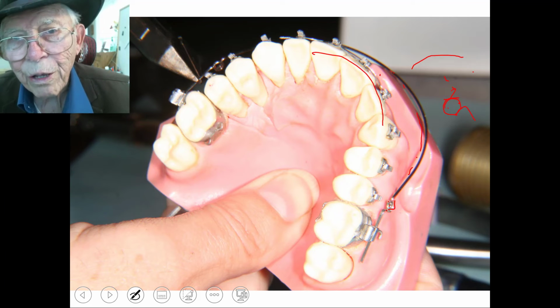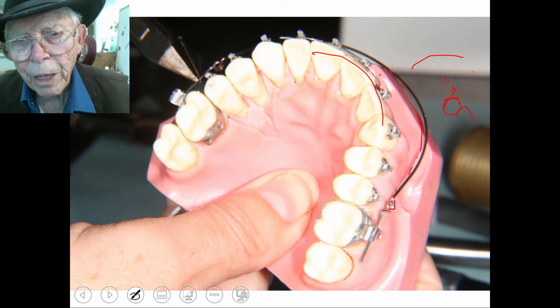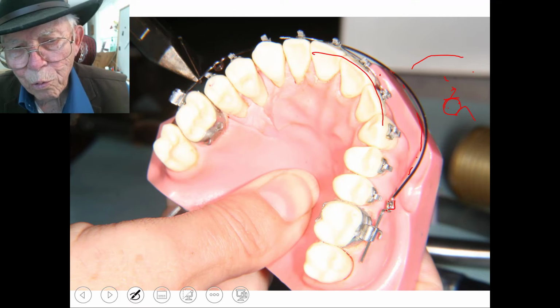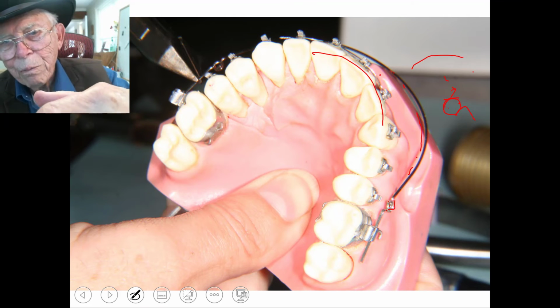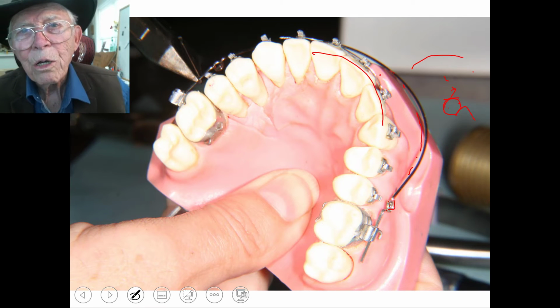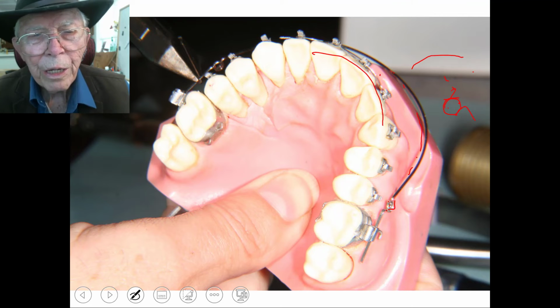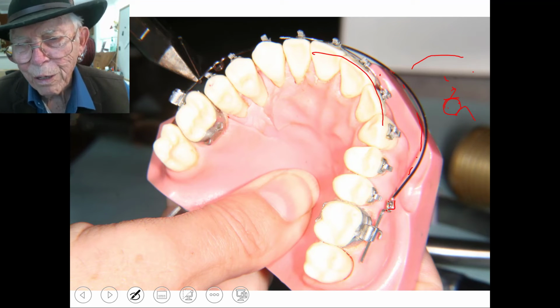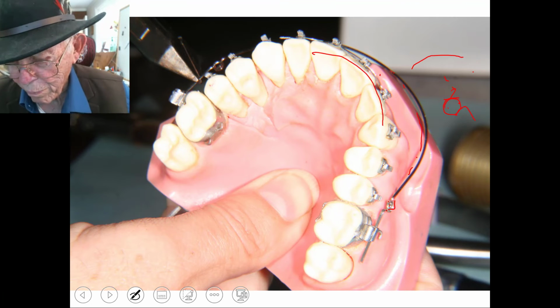I've never found anybody that couldn't elevate or intrude their upper teeth and intrude the lower teeth, and they'd be covered up like that. You can see case after case that we've shown in there, and it doesn't make any difference how old they are. They'll always go unless the tooth is ankylosed, and you know about ankylosed teeth. We have to break them loose to get them to work.